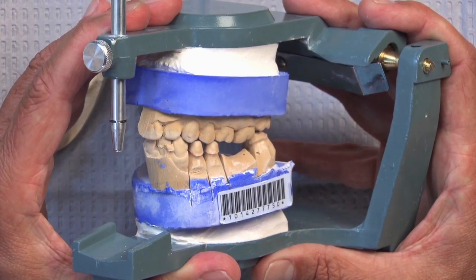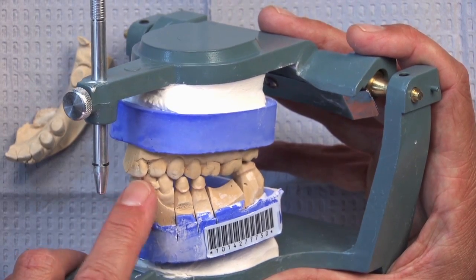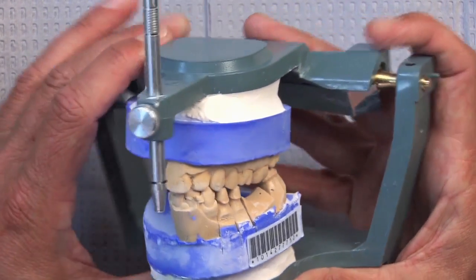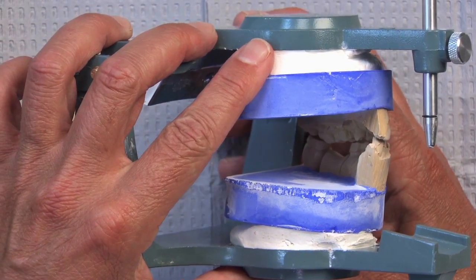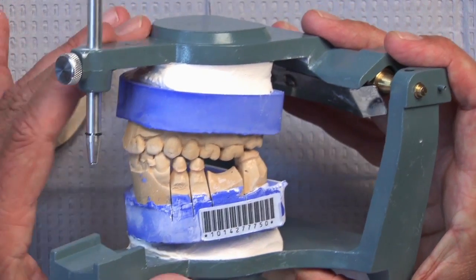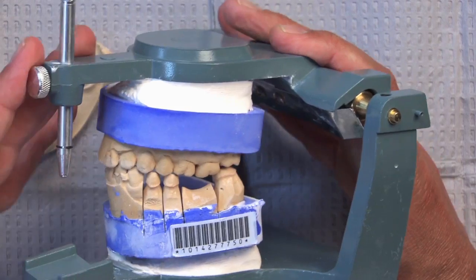As I squeeze it, you can see the upper model shift over because there's no solid contact, because we have no posterior teeth hitting here. If this impression went all the way to the other side, not only would we have a better vertical stop, but we would have some intercuspation on that side of unprepared teeth that would keep that from sliding around. And that's part of what makes this such a difficult bridge to make.